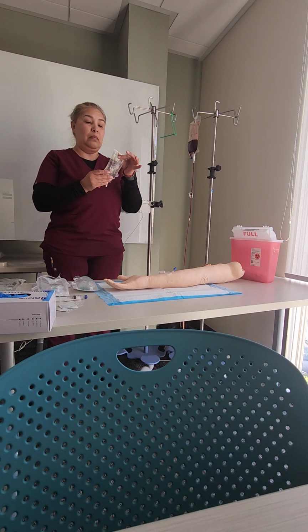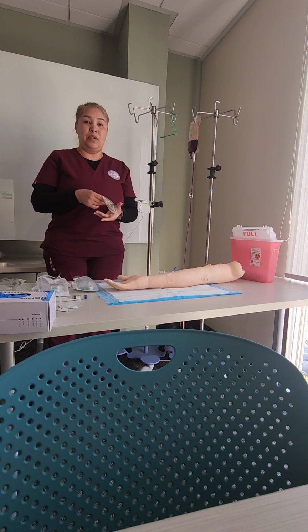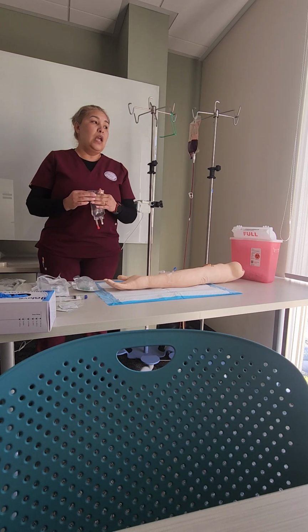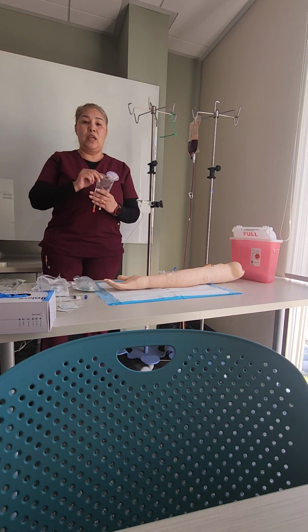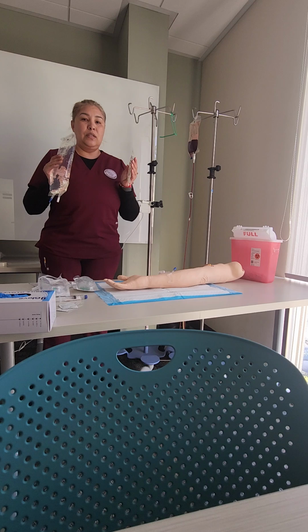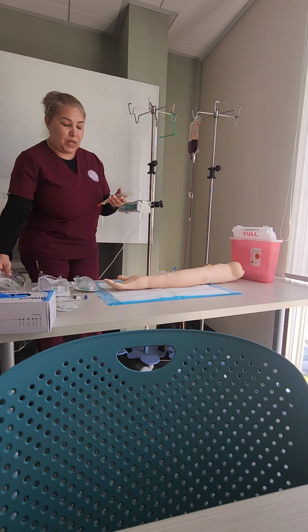I will do the same thing. I will make sure that I pull it from the Omnicell after I have checked the patient's MR. I also want to check the patient's MR for allergies, and make sure that it is not contraindicated with any other medications they are taking, and that it is compatible with the IV fluids that I will be hanging.